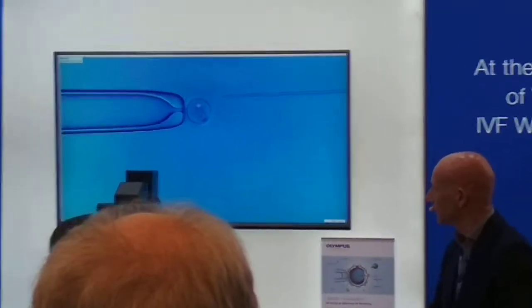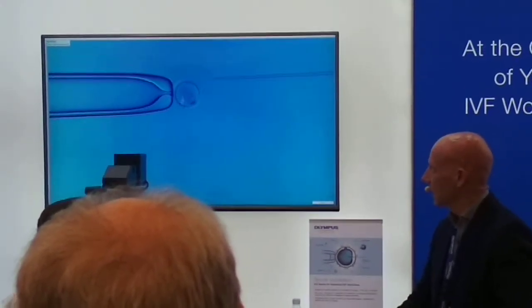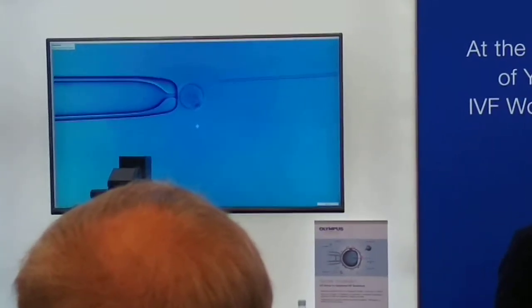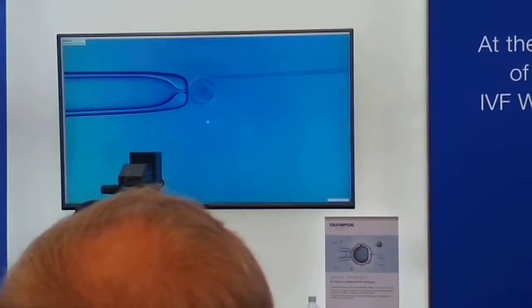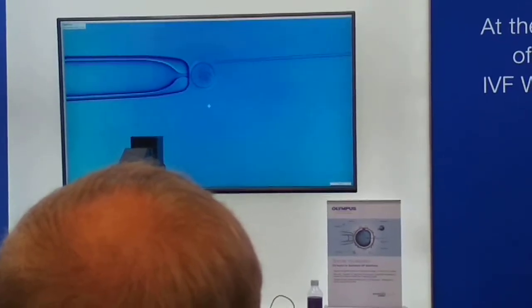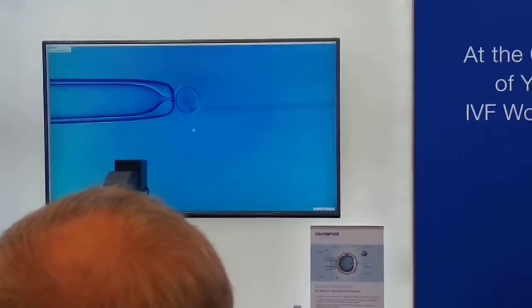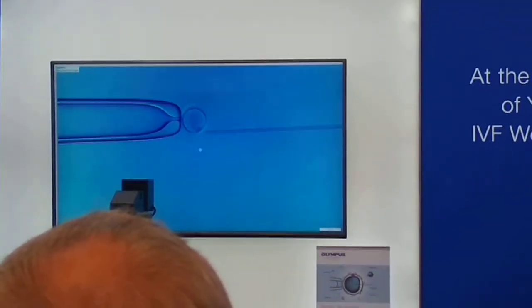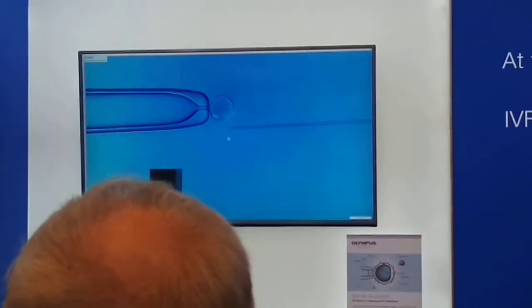Before we saw it here in this, let's say, darker image. Then we have it here more bluish. And if we continue rotating this sample, at the end we will have once more this bluish image. It's no magic, it's no contrast, it's not a digital image effect. It's just the fact of how the oocyte is rotated with respect to the orientation of the light in the microscope.